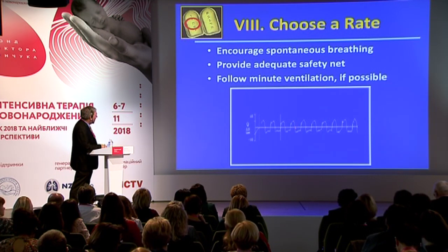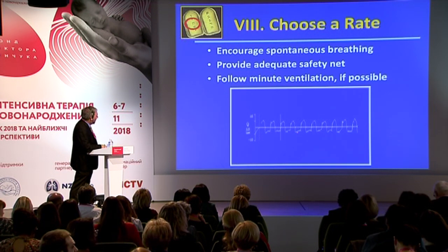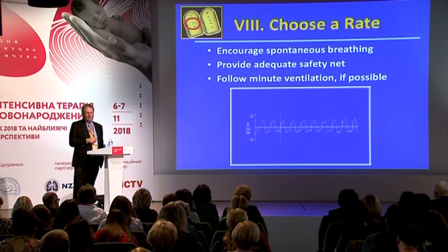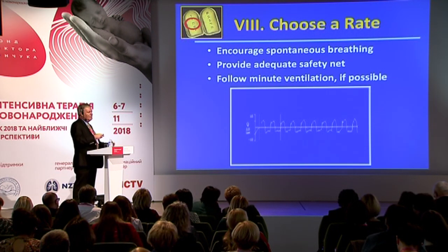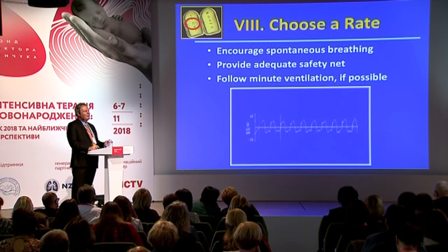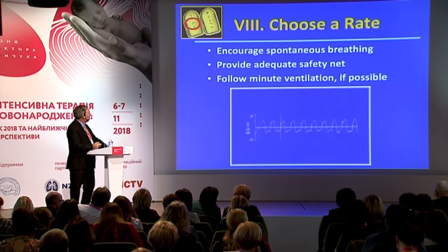Here is our accelerating expiratory flow. But on our decelerating expiratory flow, look what happens. The next breath begins before the expiratory flow has reached the baseline. So each time this baby is being ventilated, or each time this baby takes a breath that's being supported, more gas is going into the lung than is coming out.